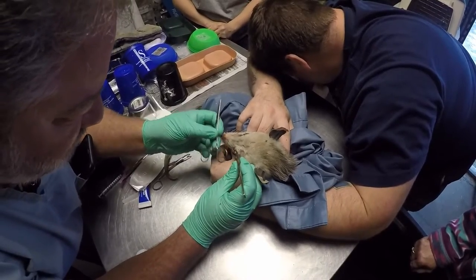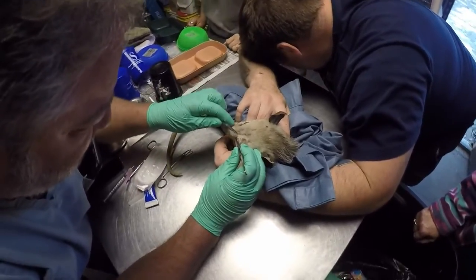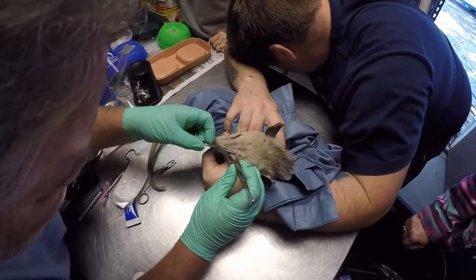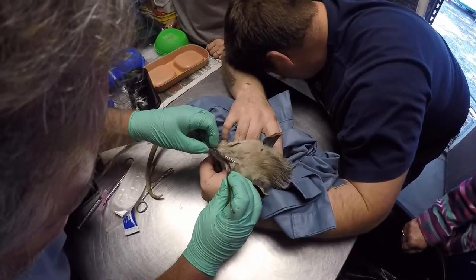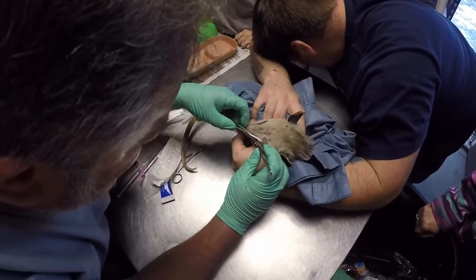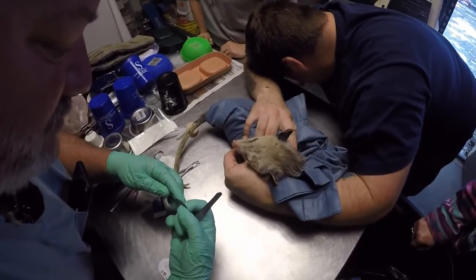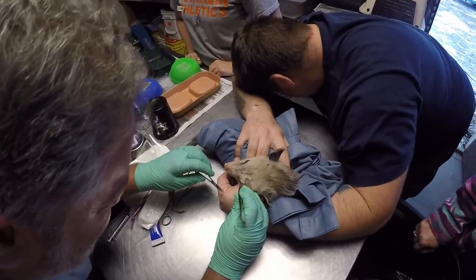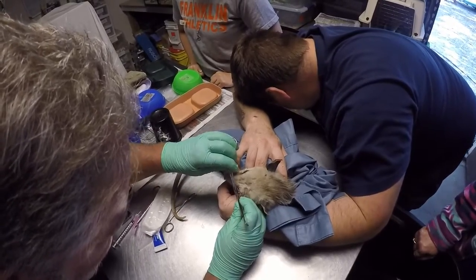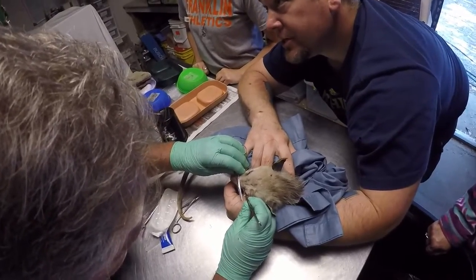Did you do the eye out already? We're not taking the eye out. Gotcha. Sweet, we're not taking the eye out. Did you hear you say that? We're not taking the eye out. I'm videoing real quick. Kyron, this is the baby that you got for us — he's trying to save the eye. It's Agent K. Could you tell us what we did here just now?